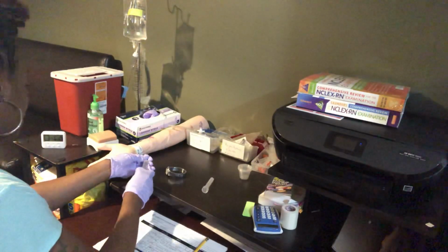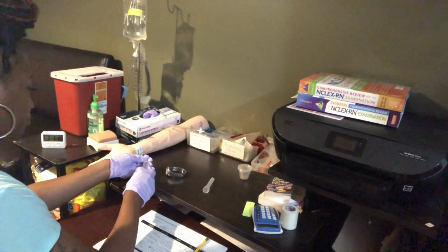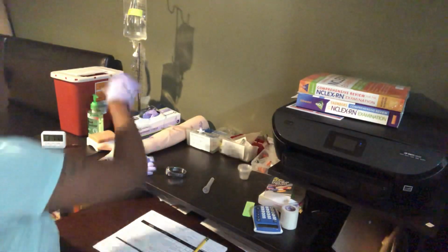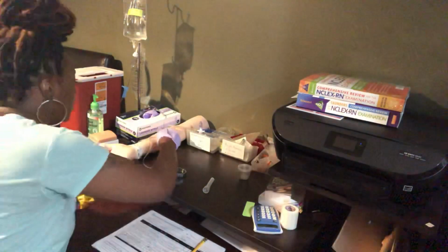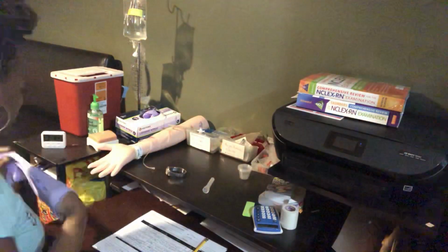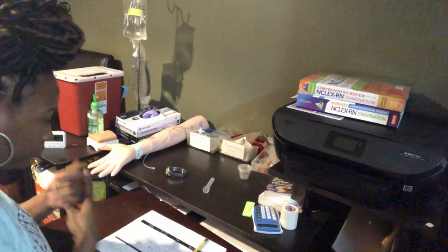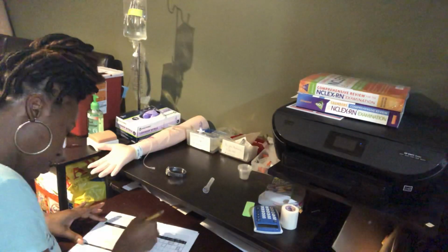Put it in there slow. Normal saline in there. Sharp container. What does it look like afterwards? It looks good. No edema, no redness. Clean your hands. Do your charting. Gave everything else.